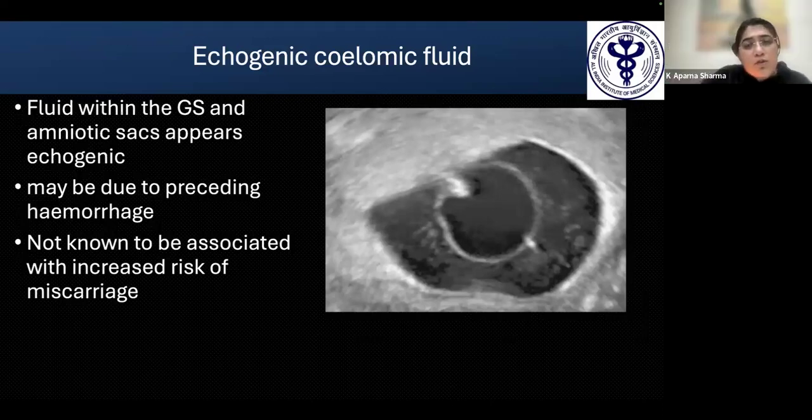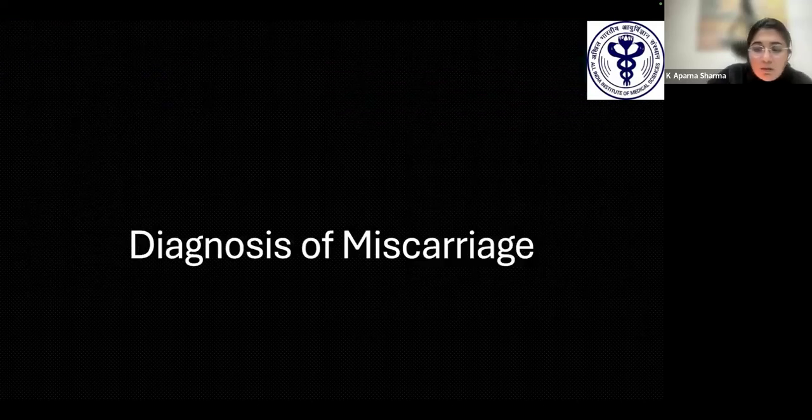Right, sir. And I think echogenic fluid we also see later on in the pregnancy, sometimes in the second and third trimester, but we really have to ignore it and move on and look at the other things. So thank you, sir. I think it's a very important message that we need to give, because we do get a lot of anxiety around it and a lot of reporting, and things can be very stressful for the patients.